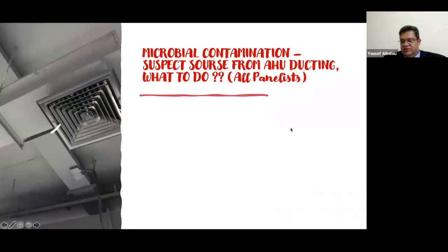Yes. First, this microbial contamination is a serious issue. The first thing, we need to inform the management about the issue and about the proposed plan. We need to make a microbiological culture for the media to see what type of contaminants we have, and make a microbiological culture for the air, to make sure that it comes from the air.